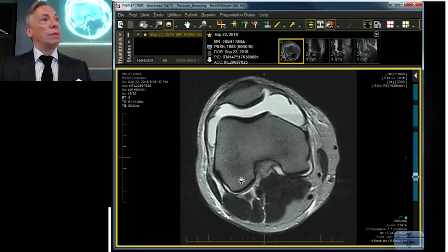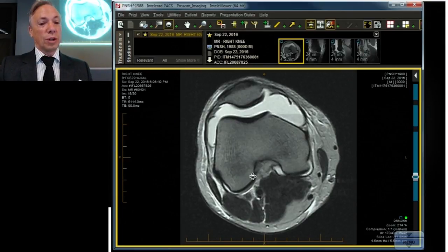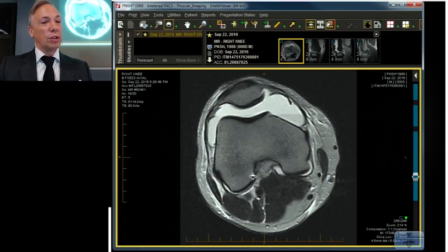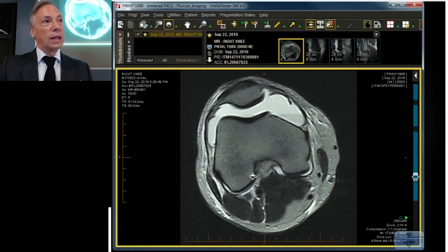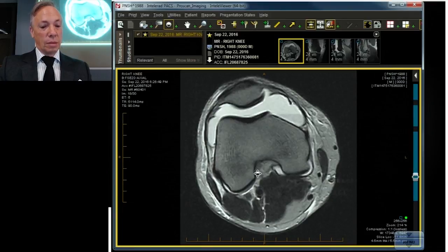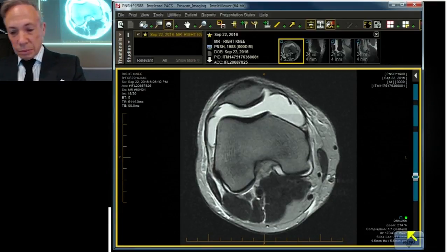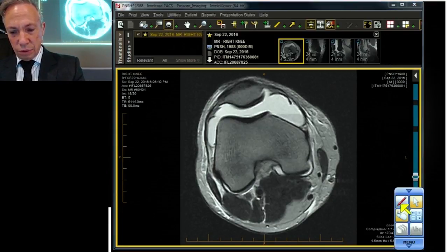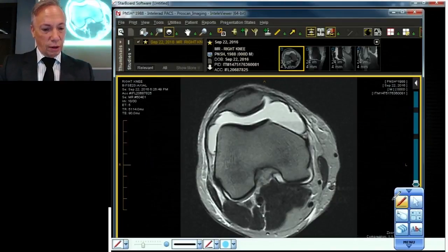This leads me to the focus of this discussion: pivot shift injuries and meniscal pathology. I don't so much care about the ACL tear I'm going to show you or the PCL sprain that you're going to see. What I'm interested in is the menisci.